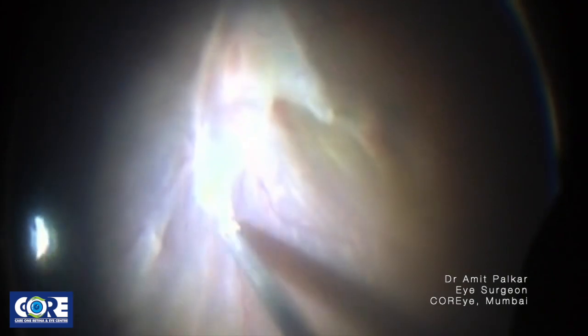I go in with my cutter, try to cut the membrane one bit at a time between the plane, releasing all the connections and tags of the membrane with the retina.